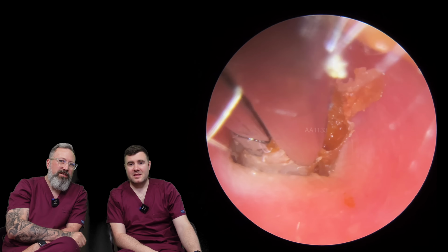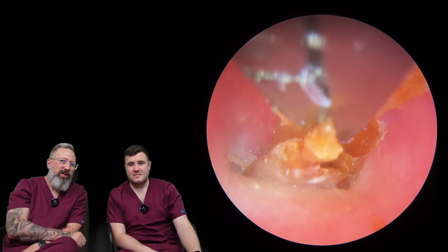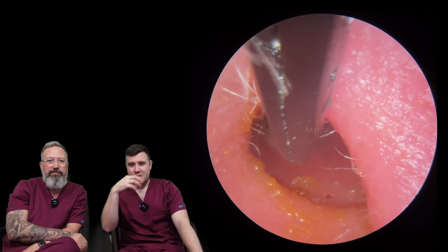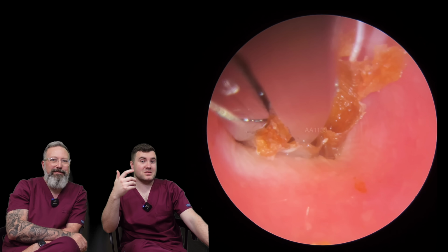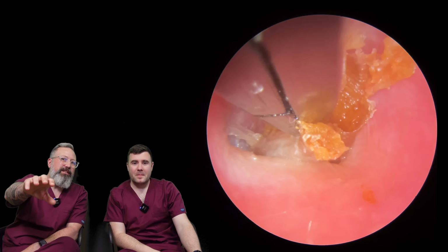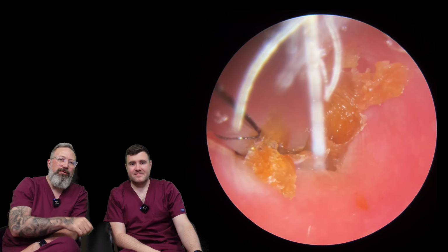But you can see just how close we've got to get to the eardrum. I'm trying to avoid that little recess there to get this out. It's so brittle, see it? Yeah, the more we take away of these little tiny pieces, the more difficult it's going to get, because we've got nothing to grip onto. So we're hoping it's going to come out in one go. The last thing you want is it to shear off just beyond the edge of that recess, because then you are going to be in a lot of difficulty getting that out.